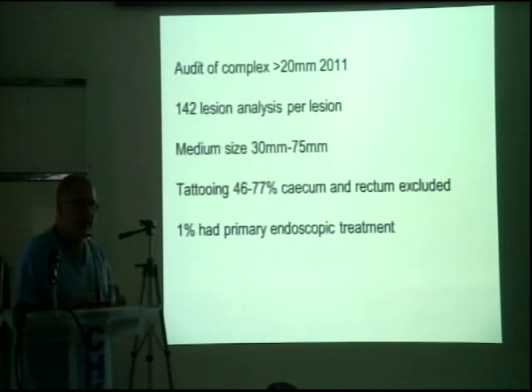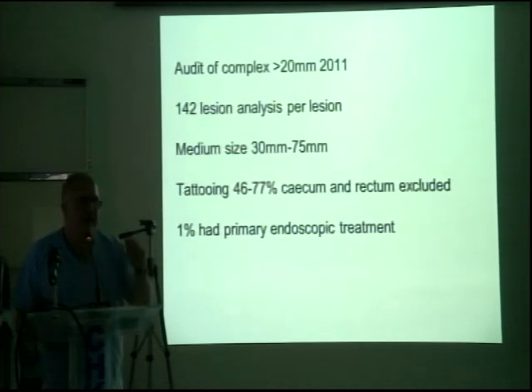Now, when you actually tattoo, if you can take a picture, great. If you can't take a picture, not so great. But what you need to do is describe. So I never tattoo the base of a polyp. Why do I not tattoo? I tattoo the opposite wall, directly opposite. But why do I not tattoo the base of a polyp? No.